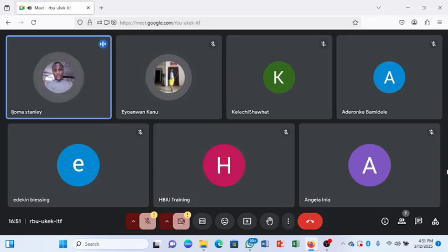They have the lavender bottle. So the lavender bottle is what we usually call the purple bottle or EDTA bottle. So the full meaning of EDTA is ethylene diamine tetraacetic acid. Ethylene diamine tetraacetic acid, that's the EDTA.